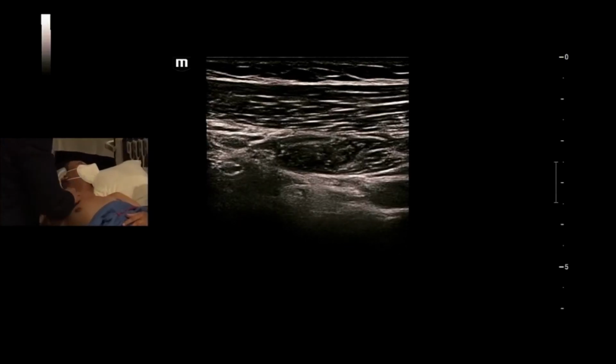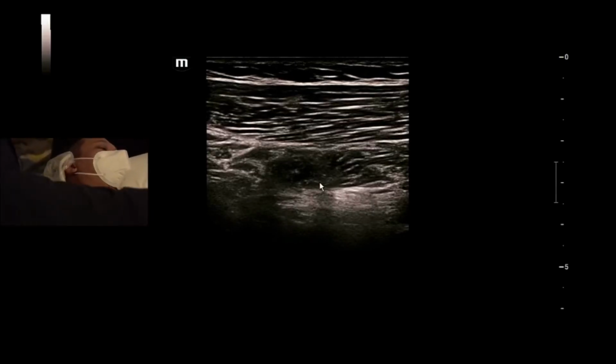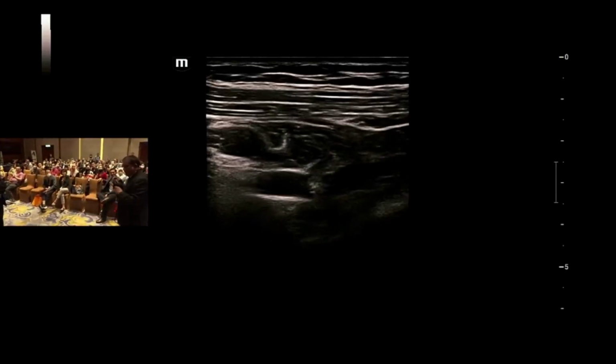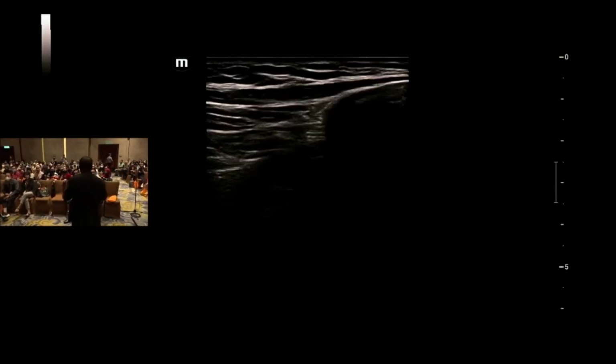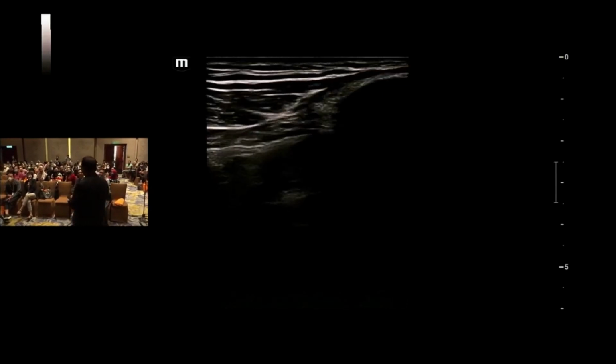Okay, costoclavicular. Prof Manoj, come. Maybe you want to help us out here. I can see that the gentleman is struggling a little bit. Now, actually, if you look at any paper, the authors describe everything, but actually the secret is between the lines. Now, if you don't read carefully, you will not find the secret. So because I'm here today, I can reveal it to you. Don't tell anybody this one.